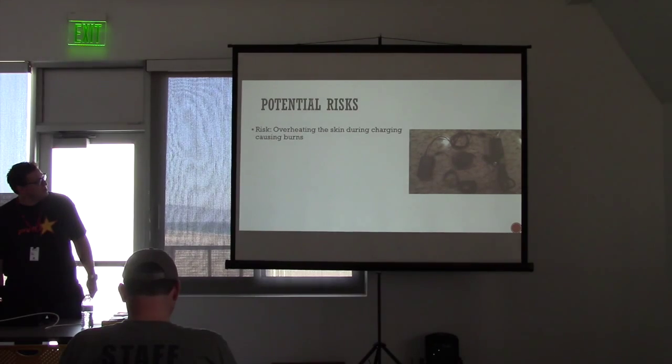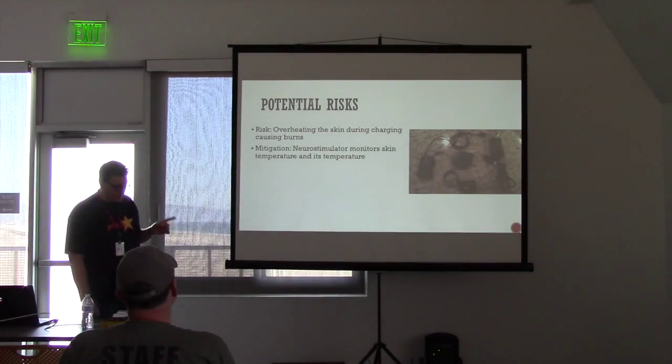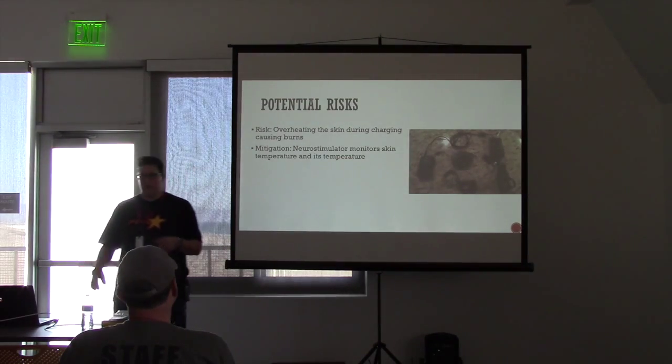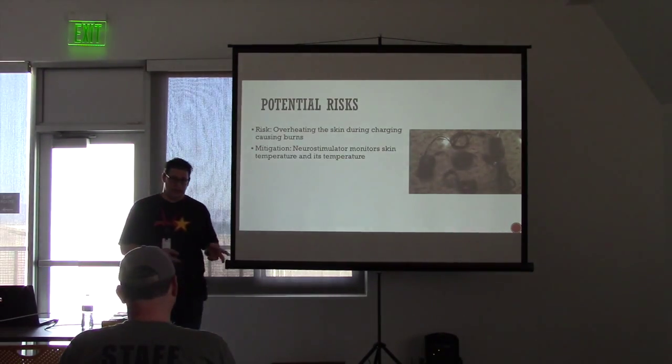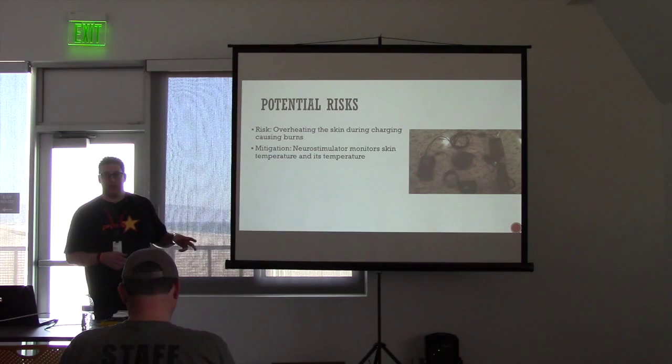Overheating of the skin during charging and causing burns. This was a very big problem with these kinds of devices before. The battery that leaks, other devices. There were many lawsuits about people who had burns, scarring, and even the inside of the skin receiving a lot of damage because of the heat.